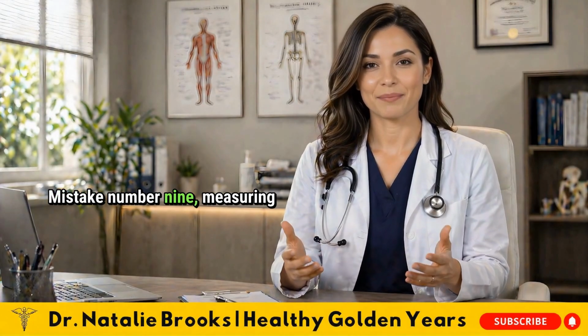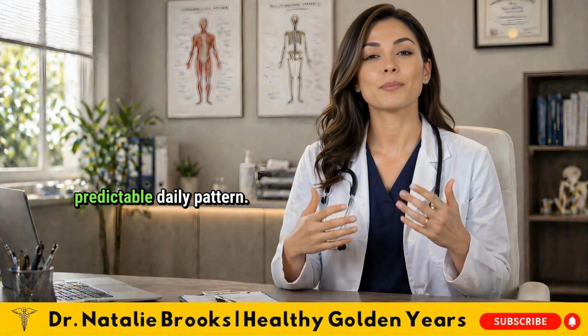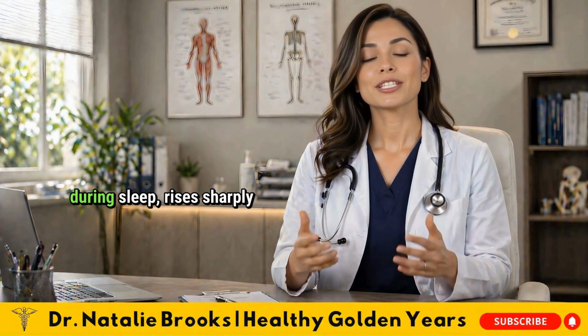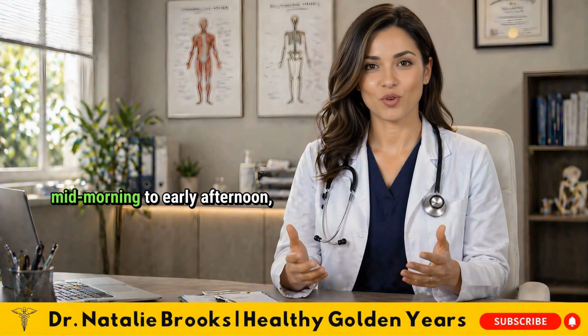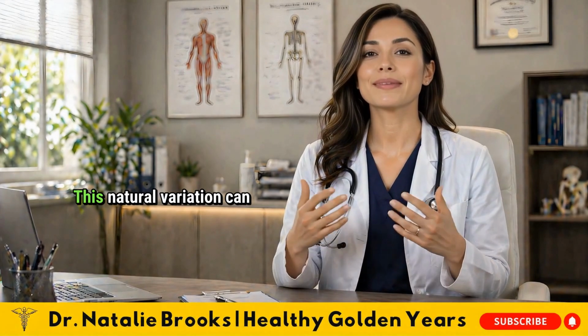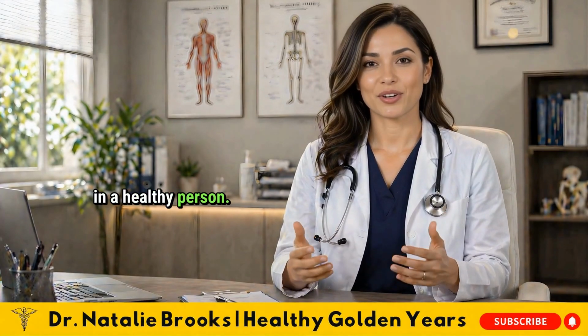Mistake number 9, measuring at inconsistent times. Blood pressure follows a predictable daily pattern. It is lowest in the early morning hours during sleep, rises sharply when you first wake up, peaks in the mid-morning to early afternoon, and gradually drops through the evening. This natural variation can span 20 to 30 points throughout the day in a healthy person.